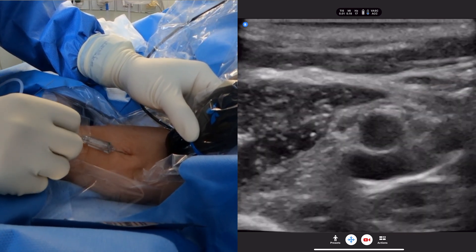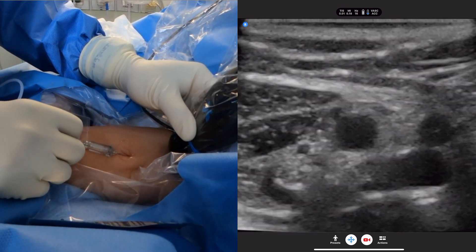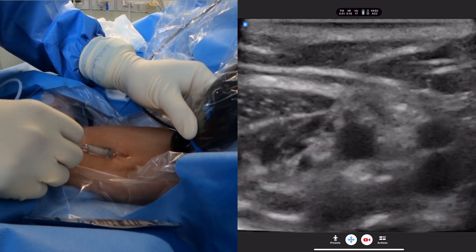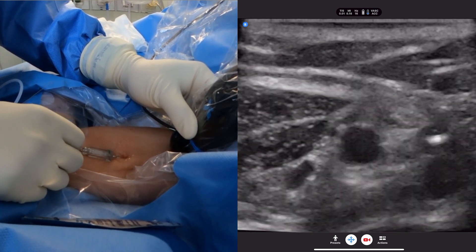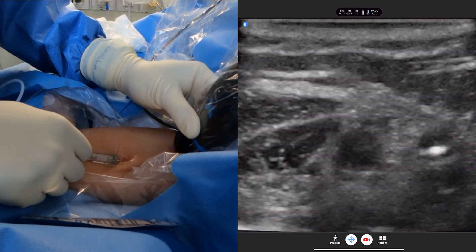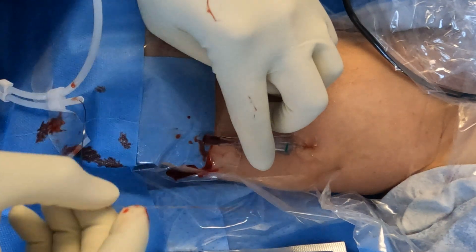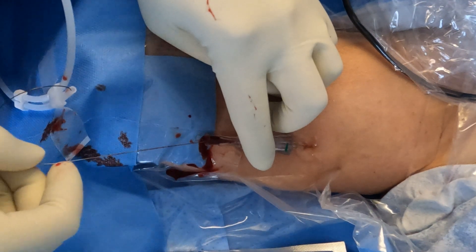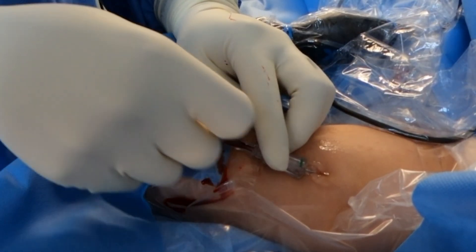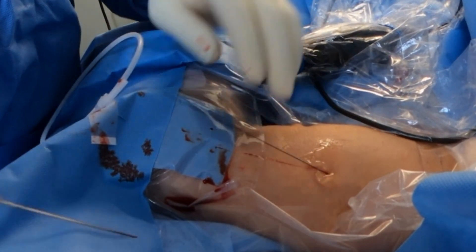Flashback on my needle. There we go. Now it's a pretty small vein. You can see me continuing to pitch up, and now I've run out of room to pitch any further. So hopefully the vein does not move more superficial. Luckily it's quite a straight line vertically. Got my blood return, and I'm going to feed the guide wire — that's a loose guide wire. Very smooth transition. Beautiful.